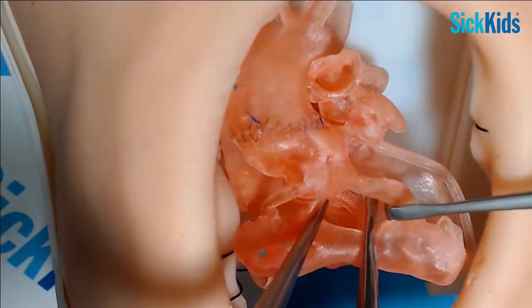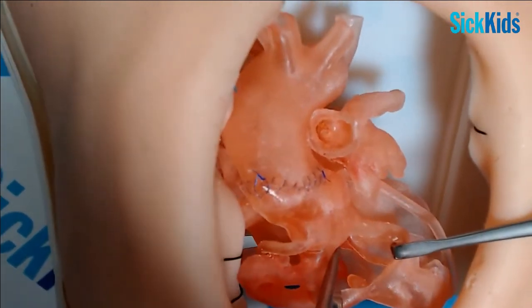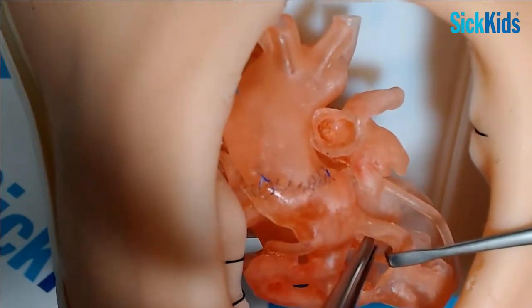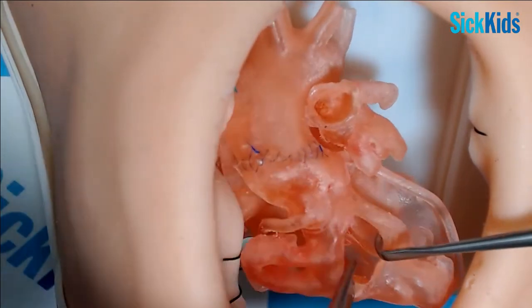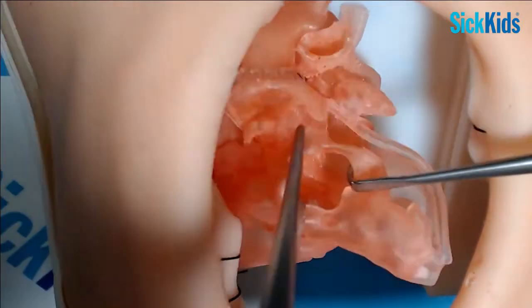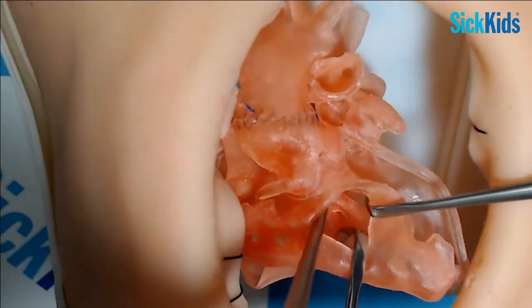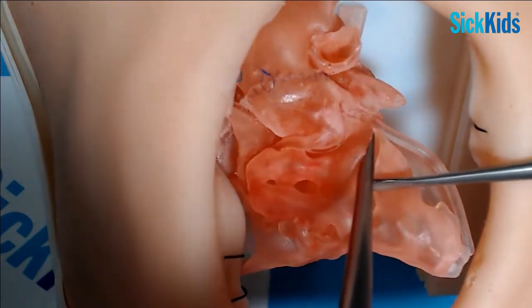It's a nice muscular outlet VSD. Yeah, so it's distant from the tricuspid valve, which is over here somewhere. So you can safely put your sutures into the margins of the VSD without the risk of causing heart block. So you look inside. You can see it's quite a long one. It doesn't come right up onto the valve as it usually does. So your patch has got to really run all the way around.